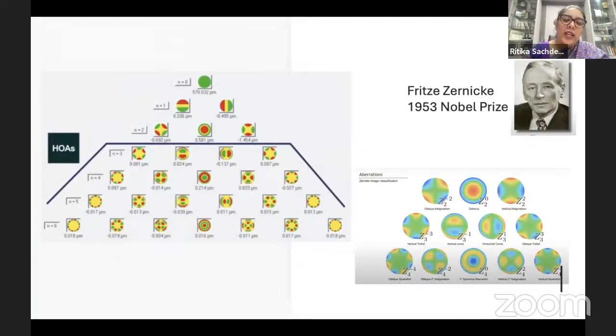This is what the glasses correct, and this is what standard LASIK also corrected. We saw that the quality of the image goes down due to aberrations other than this. So glasses alone cannot correct all the aberrations. This is where the role of higher order aberration comes in. The higher order aberrations, though there are numerous of them, you can group them into one collective identity called higher order aberrations and measure the total amount.